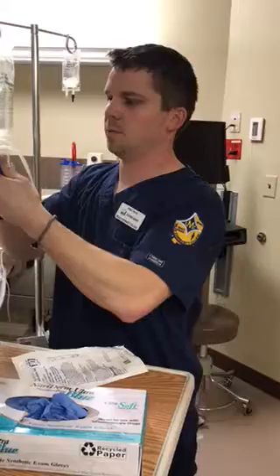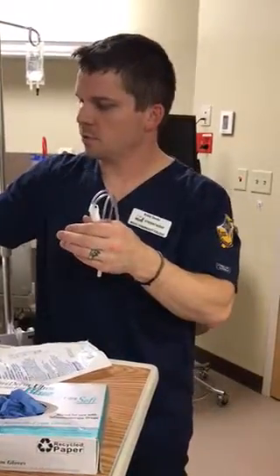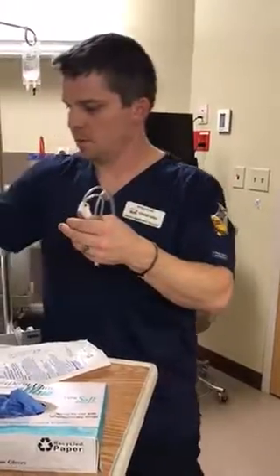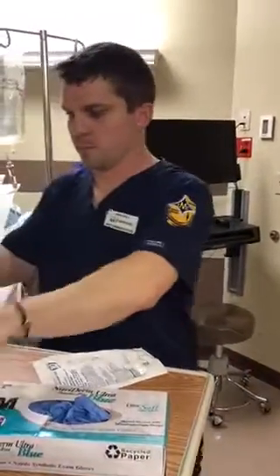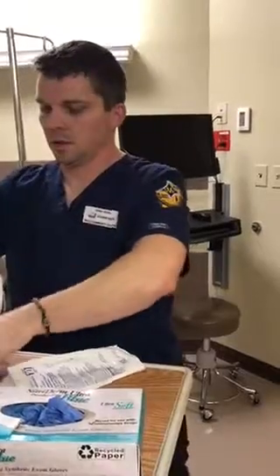Going to close the roller clamp. Going to set that for hanging it over there. And I'm going to go ahead and put that right there. And in the interest of keeping things clean, I'm going to set that right there.